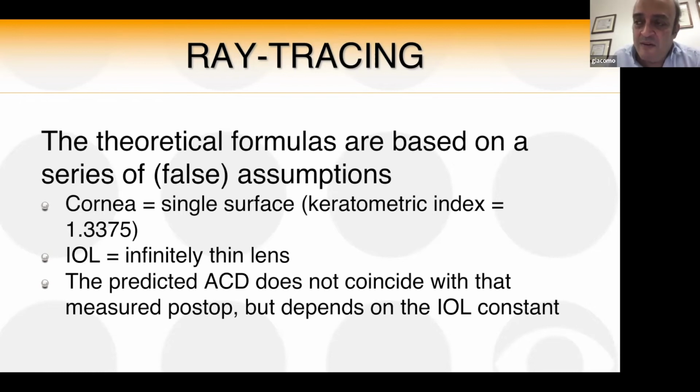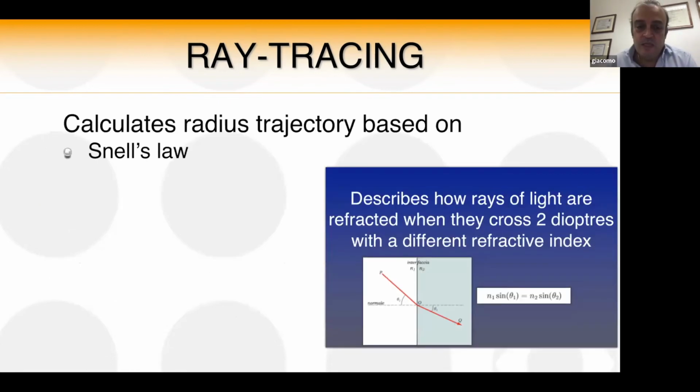So you can never make a comparison between the predicted ELP by theoretical formulas and predicted position of the lens by ray tracing, which is a thick lens model.